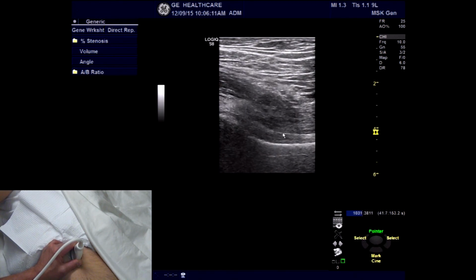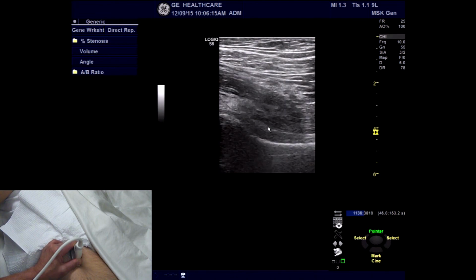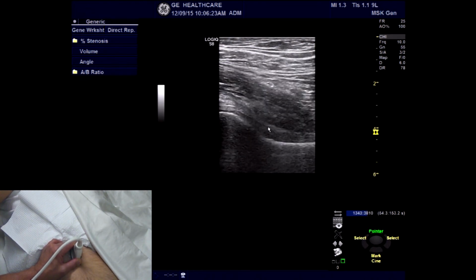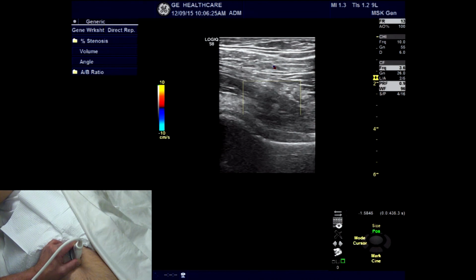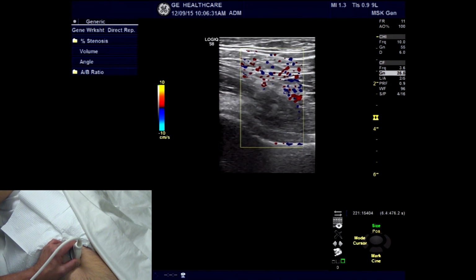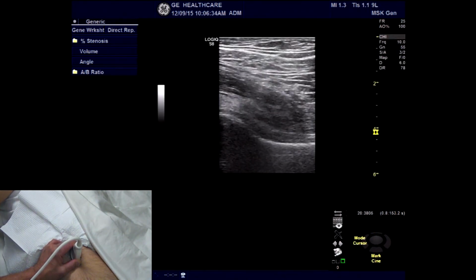And this is a common area for injections into the hip using ultrasound guidance from the lateral to medial approach. It's always wise, before you do any type of injection procedure, to turn on your color Doppler to make sure that there are no vessels in the area along the guide path for your needle. Simple look of the color Doppler.